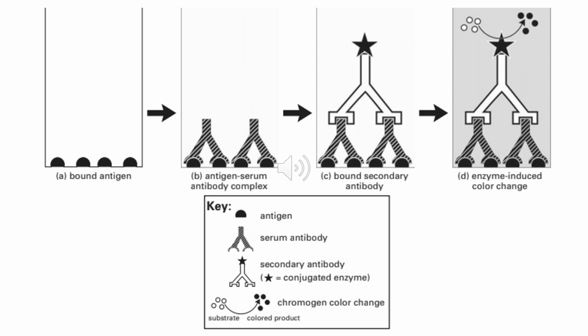Now, we don't have a way of seeing that with the eye, so the ELISA test uses the secondary antibody, which is general and binds to a primary antibody. The secondary antibody is labeled with an enzyme, so that in the fourth step, we can add a chromogenic substrate that will change from colorless to purple when it's oxidized by that enzyme. So that allows us to see it with the eye, whether the patient is positive and has those antibodies or whether they're negative.